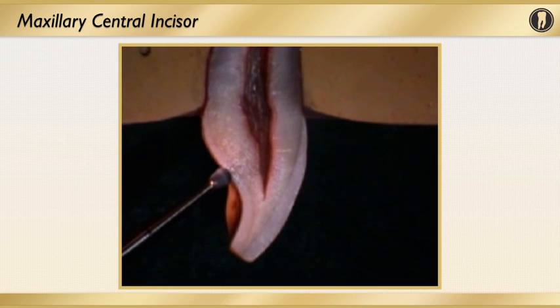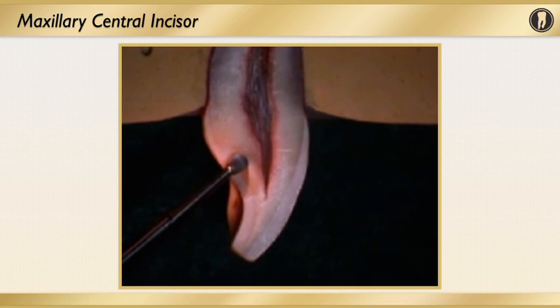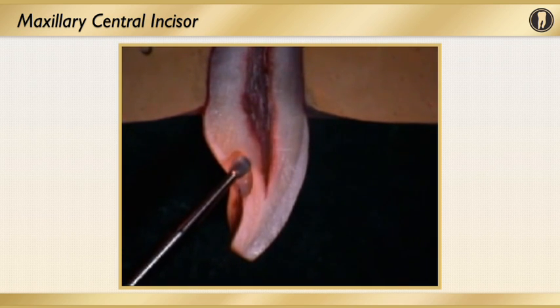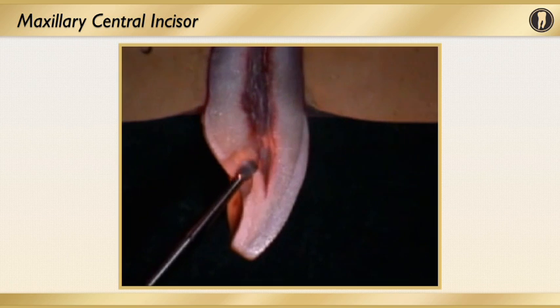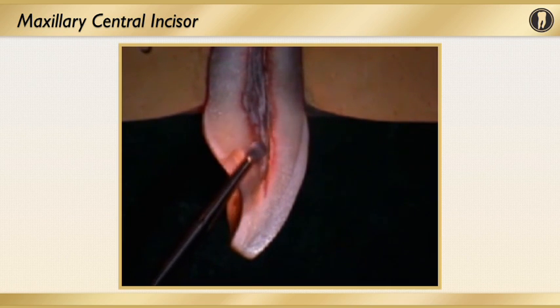They're taking a number 2 round diamond, and they're taking small bites, being careful, being gentle, and they're taking their time. In this case, they're just going to go right to penetration phase and penetrate the pulp chamber. They penetrate in. Now they're doing a little bit of an enlargement of the access, and they're being very careful, very gentle as they're slowly just taking away small bits of tooth structure.